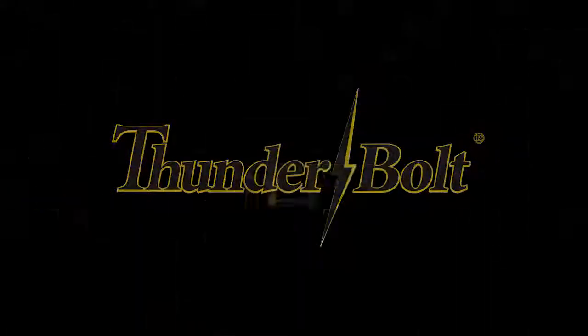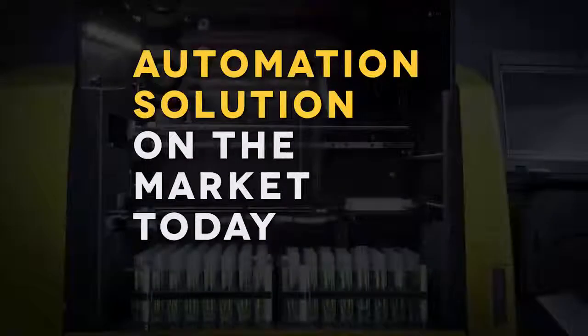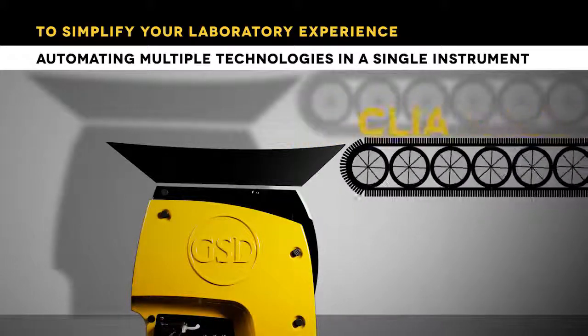Meet the Thunderbolt, the most flexible, compact, capable microplate automation solution on the market today. The Thunderbolt is ever evolving to simplify your laboratory experience, automating multiple technologies in a single instrument.